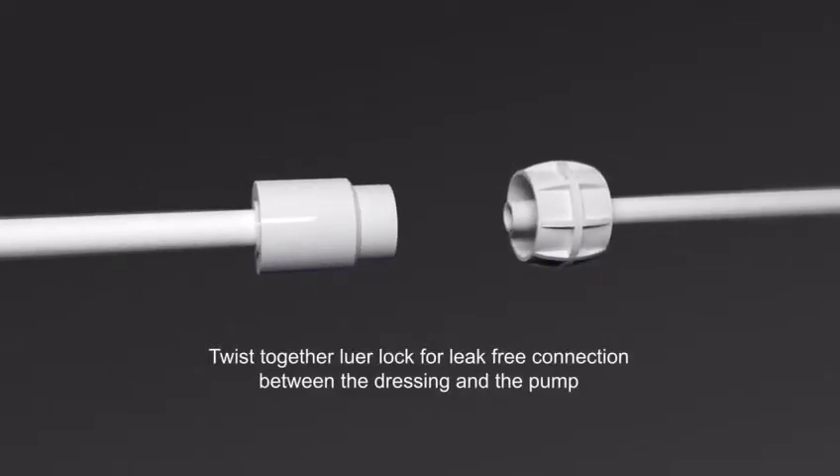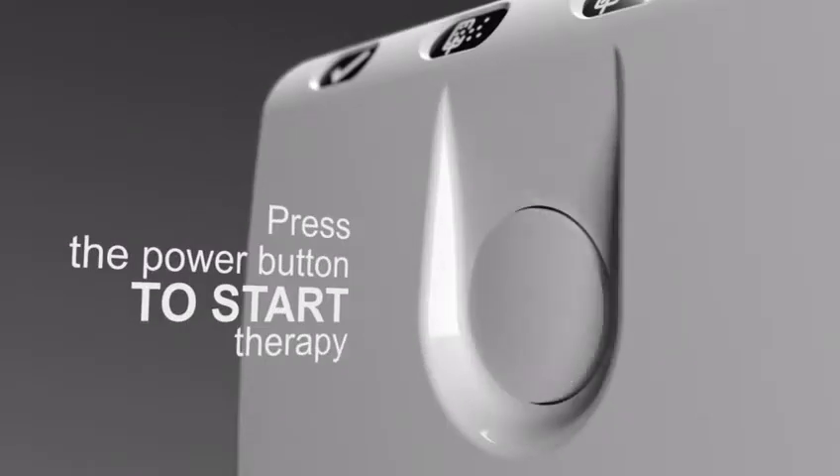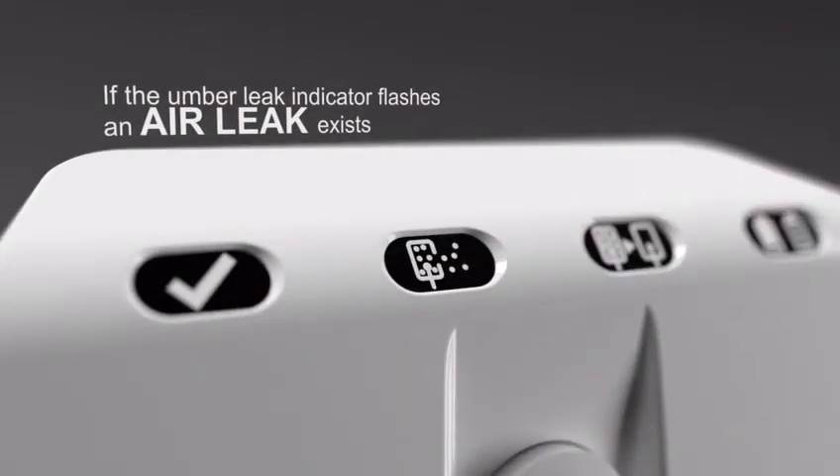Twist together the luer lock for a leak-free connection between the dressing and the pump. Press the power button to start therapy. If the amber leak indicator flashes, an air leak exists.